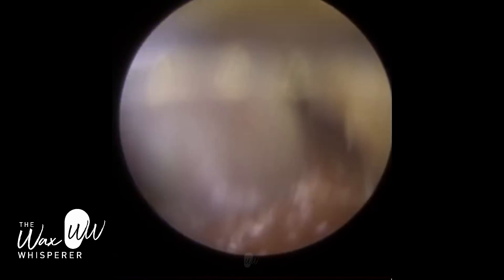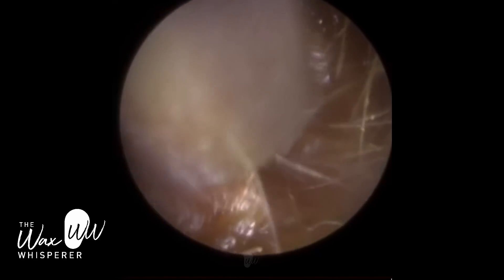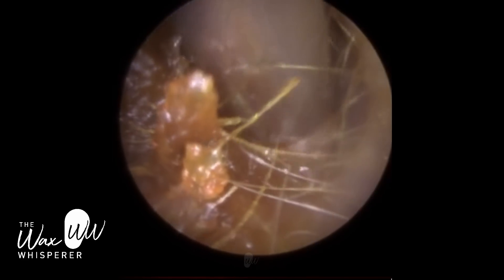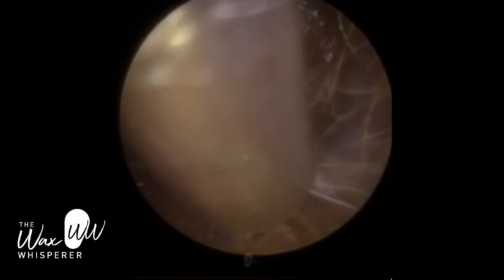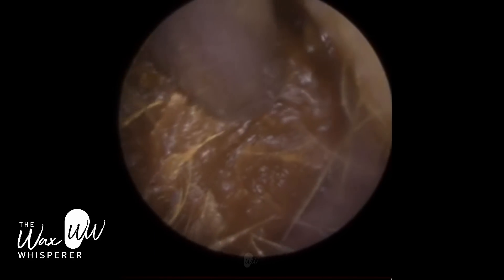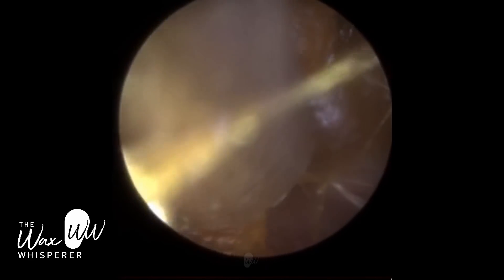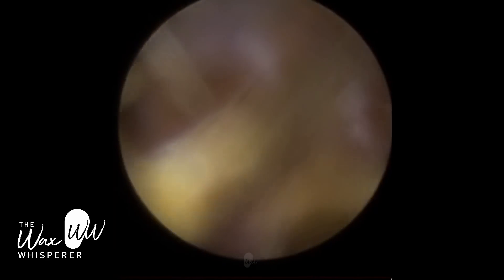That was the patient's left ear; we're now onto the patient's right ear. I put some drops in straight away before I even performed the procedure, because I was assuming it would be just like the patient's left ear. The earwax in this ear is slightly lighter in shade — not as dark as it was in the left ear. Quite often the longer the earwax is in the ear, the darker it becomes as it ages. In fact, scientists can sometimes estimate the age of a whale by the colour, texture, and consistency of their earwax, and can also decipher migration routes and diet by examining it — so that's something new to learn every day.